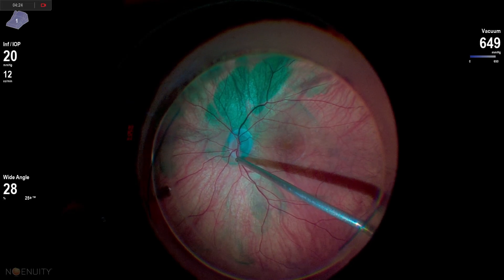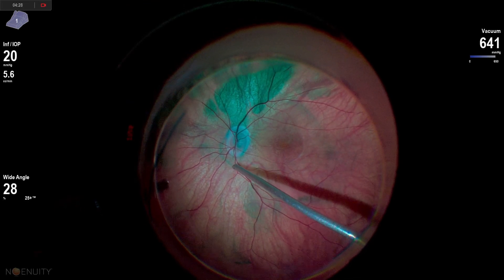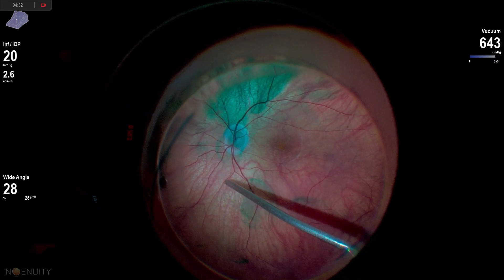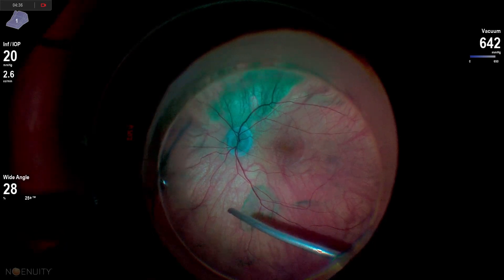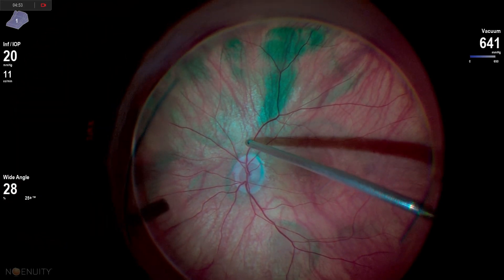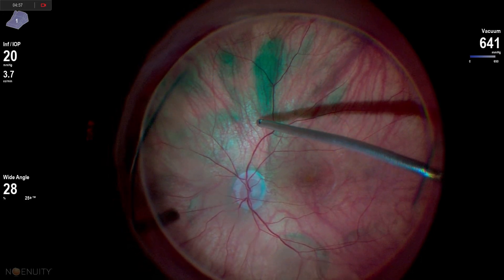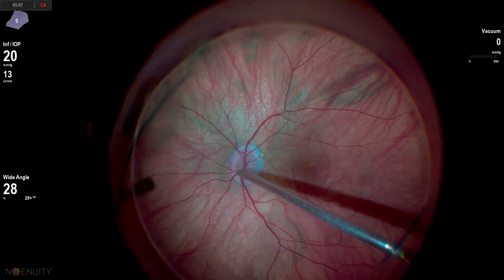You have to be very confident and comfortable with that so that you don't auger into the retina as you're going up and out, but it can be successful. I actually had to utilize ICG to help stain the vitreous — I use it almost like Kenalog to stain the vitreous and see how it's reacting. There are a few keys to getting a successful vitreous separation: one is full occlusion of the vitreous in the cutter, the second is this up-and-out motion, and third, if necessary, visualization.